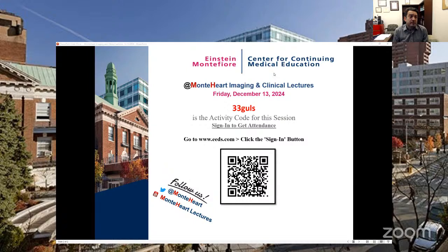So I've done research with CT perfusion and I interact a lot with many people that have done many of the main papers in CT perfusion. I think it works. It's not as good as probably PET or MRI, but it's not as bad as some people make it sound. If you know how to do it, it works out well. There are some caveats in terms of workflow, because unless you believe everybody needs a stress perfusion for CT, you usually start with the rest.